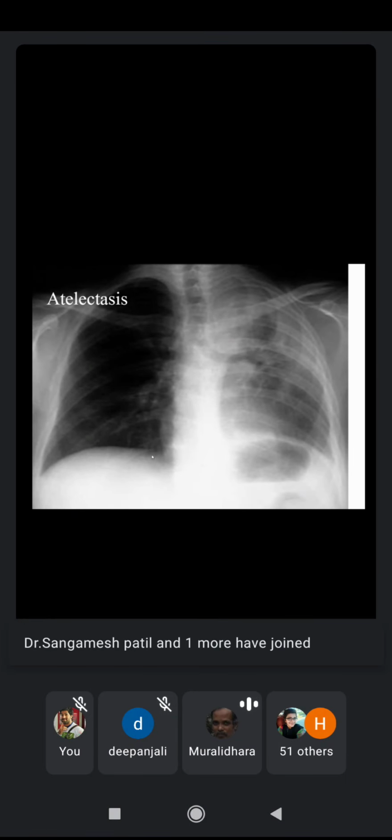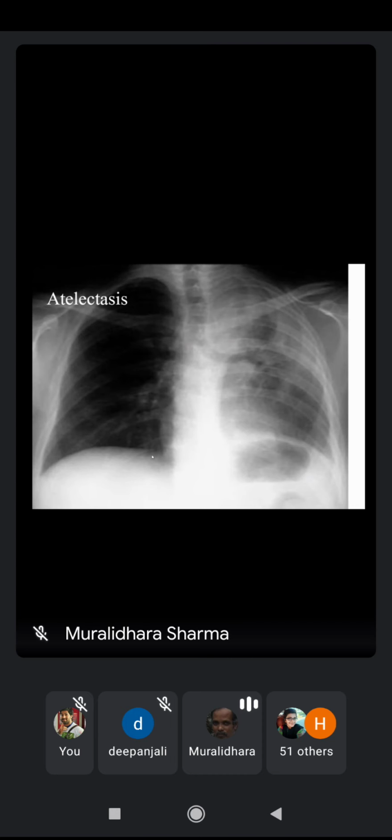So that's about the fibrosis and consolidation phenomena. The next part which we discuss would be atelectasis.